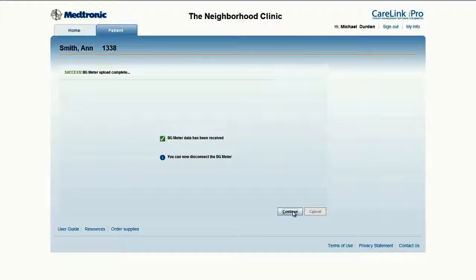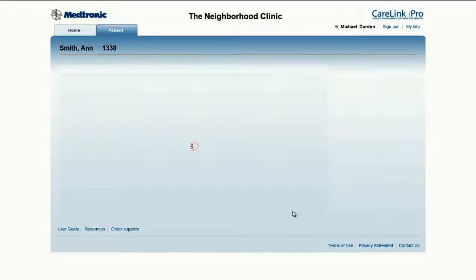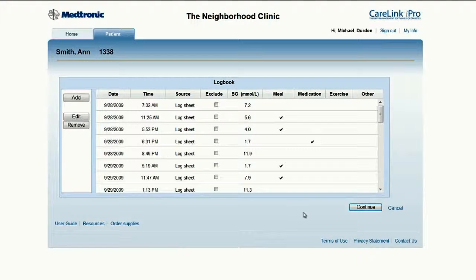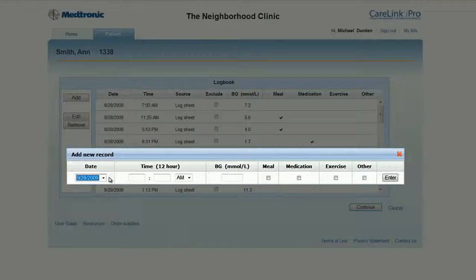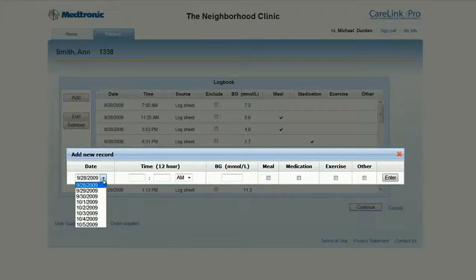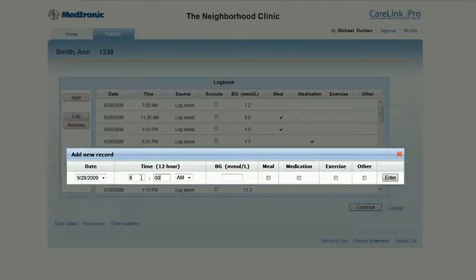Click Continue to open up the logbook, which is generated from the uploaded data from the meter. Anne's OneTouch Ultra 2 meter has the functionality to capture events, and she did a good job entering them. However, she did forget to capture one and it will need to be entered. Note that had she been using another meter without this functionality, none of the events would have been captured and they would all need to be entered manually. To enter events manually, click Add. This opens a small window. Her log sheet shows that on September 28th at 8 a.m., she had a meal and gave herself insulin. This will be useful when looking at the reports to see cause and effect in postprandial patterns.